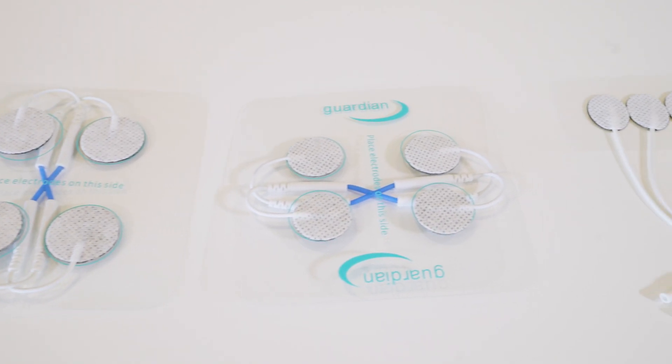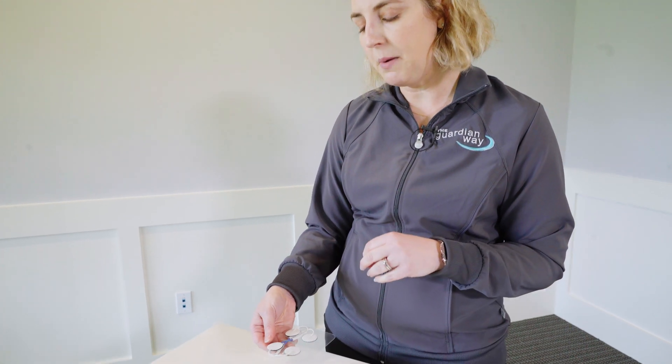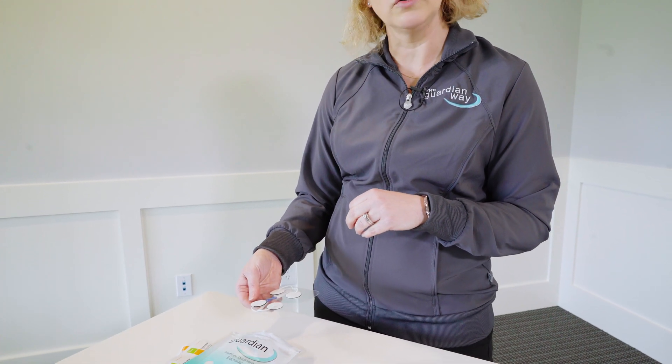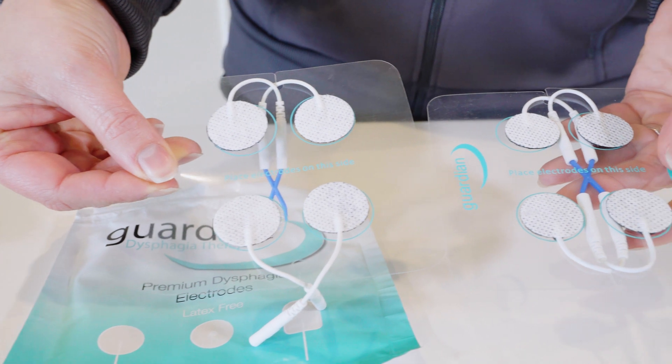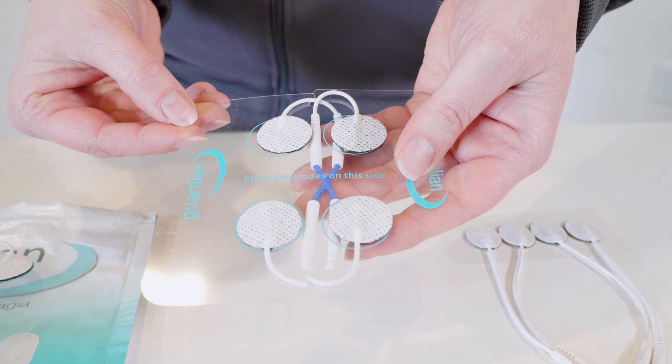We have multiple sizes, so I want to walk through those for you. Our one-inch round is used for most adults and is a popular size because it's so versatile. If you compare that, you'll see that you can size down to the 0.87 round.